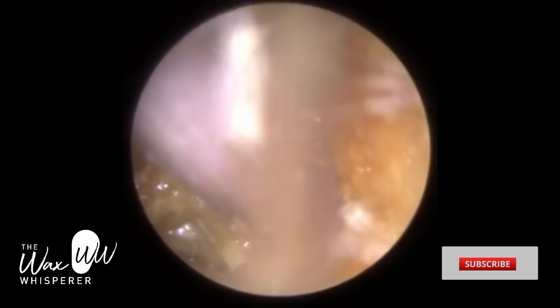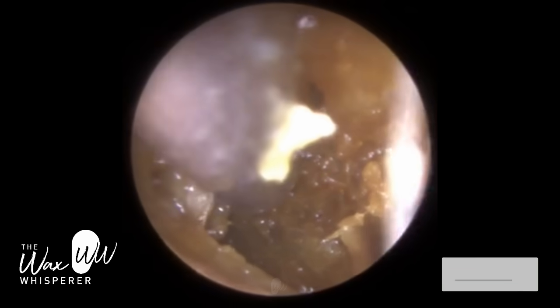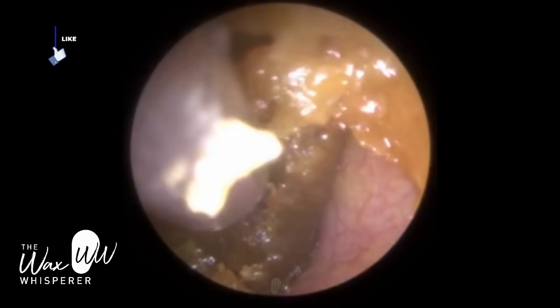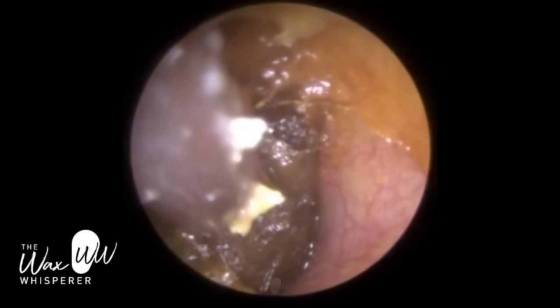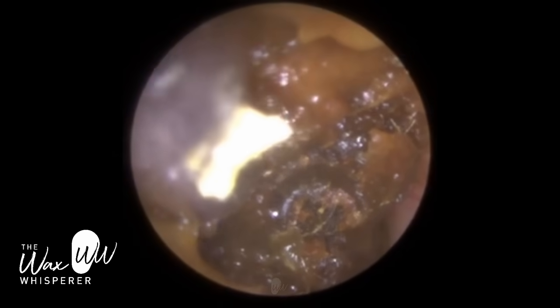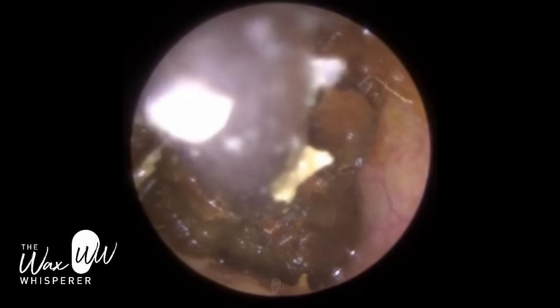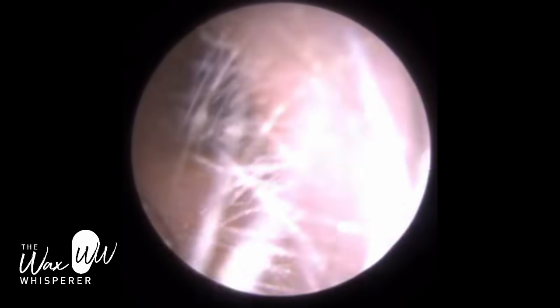We had a client attended here, and I think a lot of people will enjoy this procedure for one of two reasons. In the left ear, which is the ear we're performing the procedure in, there's a huge plug of earwax that I've removed off the patient's eardrum - you'll see that in a moment. And the right ear, that's for all the people that really enjoy the dead skin peels. The skin peel on the right ear will be after this left ear. It's probably one of the toughest, thickest pieces of dead skin that I've removed and it was a bit of a challenge.